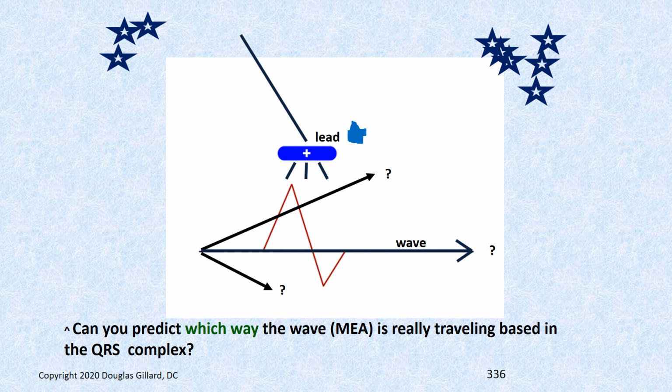How do you do that? Well, you look. Is it perfectly biphasic? No. So it can't be this one. Right? If it was perfectly biphasic, then it would be. I mean, the view of the camera is straight down. If there's a 90-degree angle here, that's perfectly biphasic. But that ain't happening because it's bigger here and smaller here.